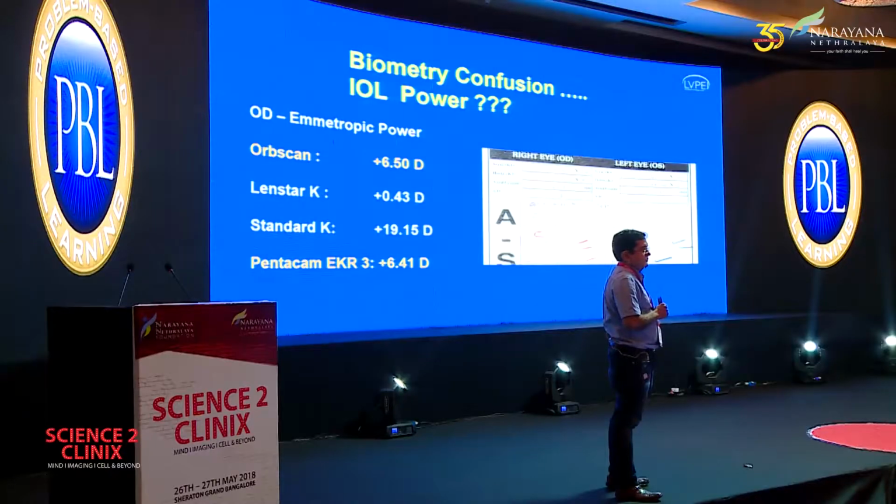Damien, the mathematician. Thank you. I think I would do another set of investigation. With the Pentacam, you can do a Fourier map of the corneal curvature, so it gives you an average power in the center in particular. But for the formula, I wouldn't use the SRK II at all.